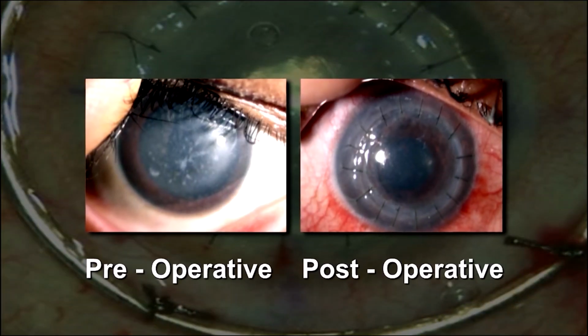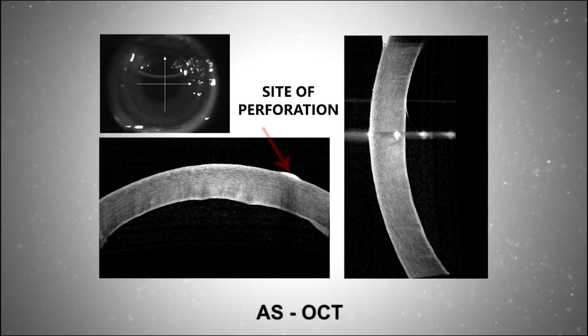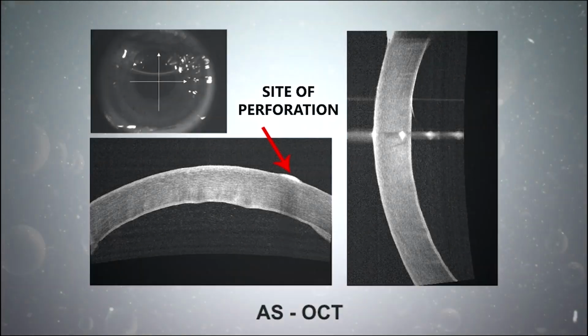On the first post-op day, the graft was compact and clear. There was no evidence of double anterior chamber, which was confirmed with an anterior segment OCT.